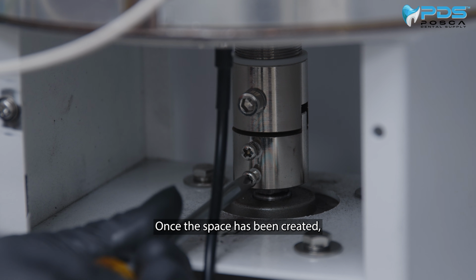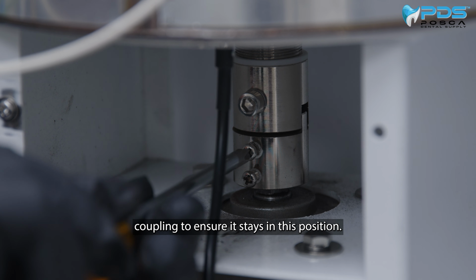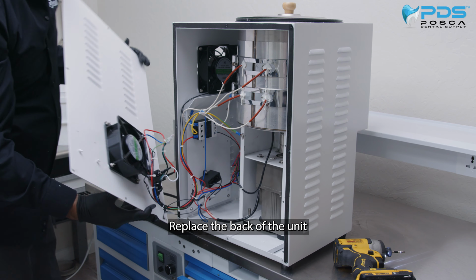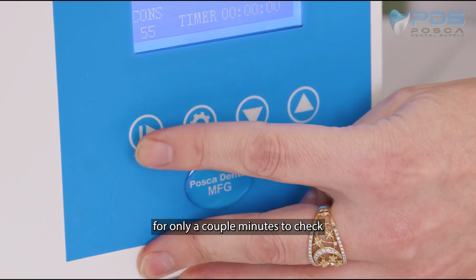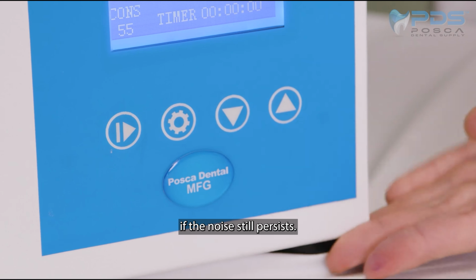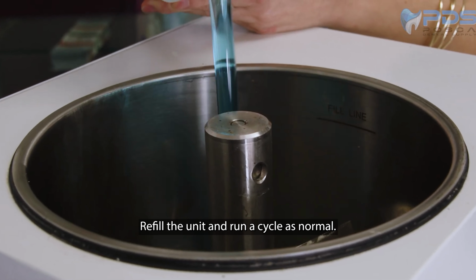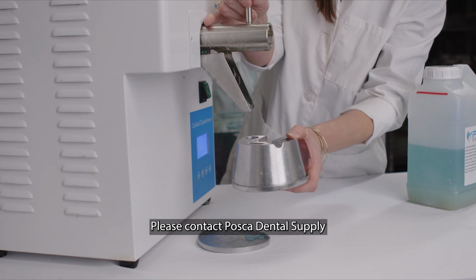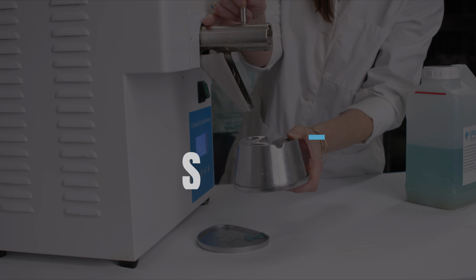Once the space has been created, tighten the 2 screws on the bottom coupling to ensure it stays in this position. Replace the back of the unit and turn the unit back on for only a couple minutes to check if the noise still persists. If there is no noise, refill the unit and run a cycle as normal. If the noise remains, please contact Posca Dental Supply for further instructions.